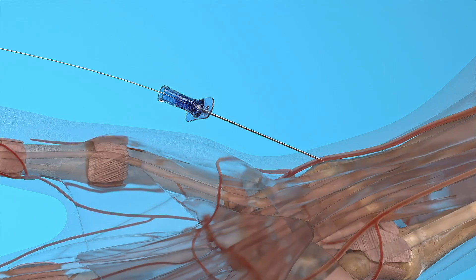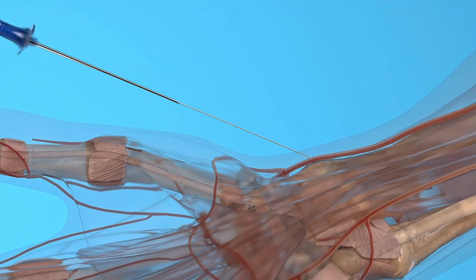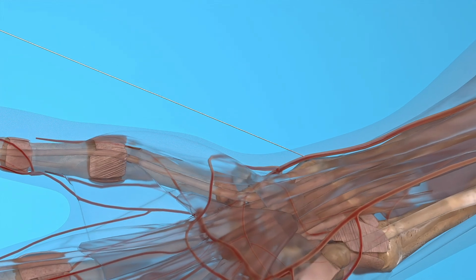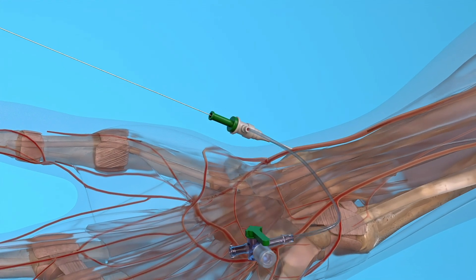After accessing the artery, a hydrophilic wire is introduced through the needle using the Seldinger technique. Once the needle is removed, an introducer sheath is placed into the artery.